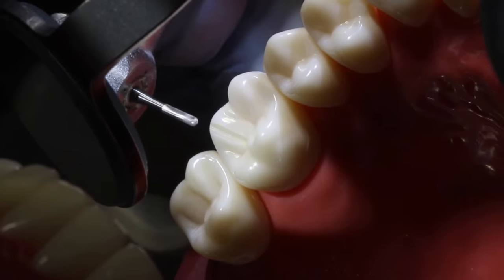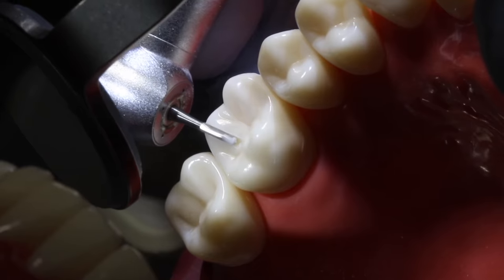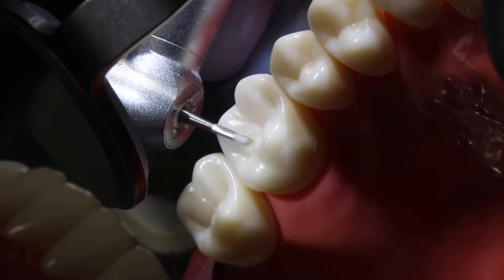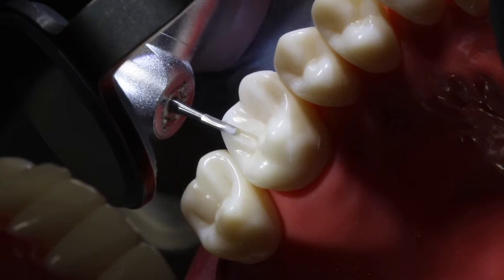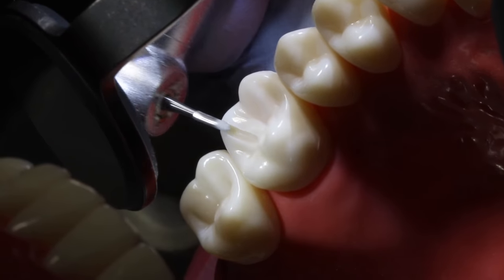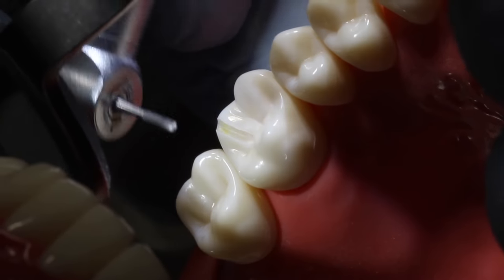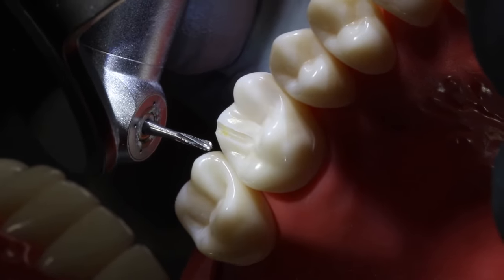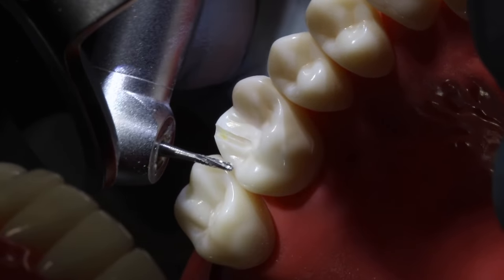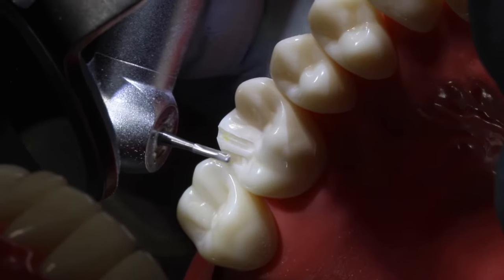Our total occlusal reduction, when we're all finished, we want to be 1.5 to 2 millimeters. Uniform occlusal reduction. And so with our guide cuts, we're going to stay close to a millimeter. We don't want to overdo the guide cuts, or sometimes you end up going deep by the time you've refined your preparation. The other place where we can put guide cuts, if we do our preparation in this order with the occlusal reduction first, is near the distal marginal ridge in the groove.